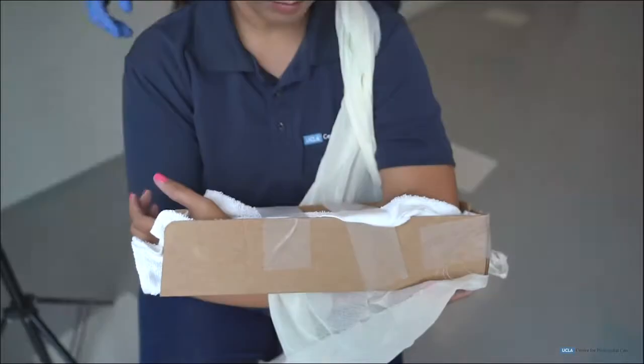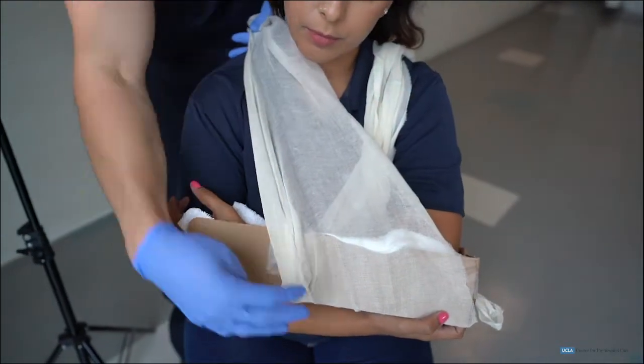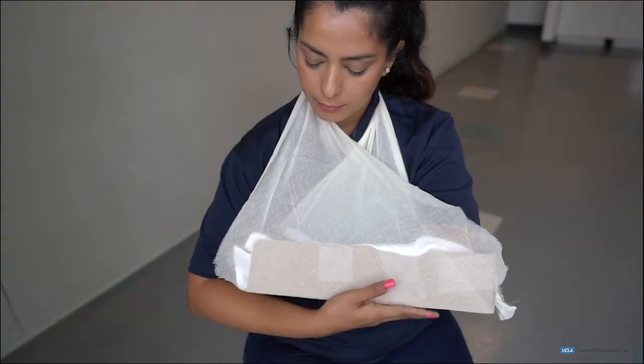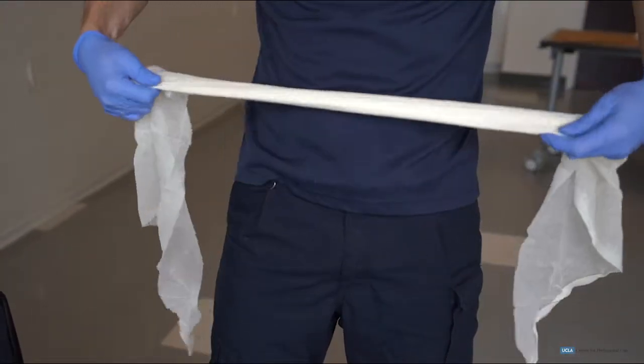By applying a splint near the elbow and farther up the humerus, the elbow will be properly splinted to the patient's body to reduce excessive movement during transport. By securing the wrist slightly higher than the elbow, swelling will be less likely to develop in the patient's wrist and hand.